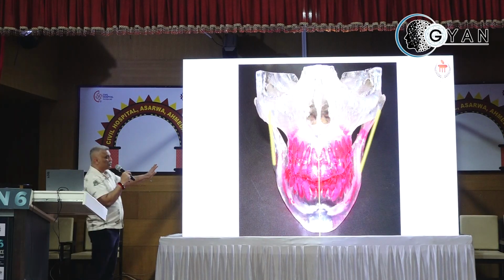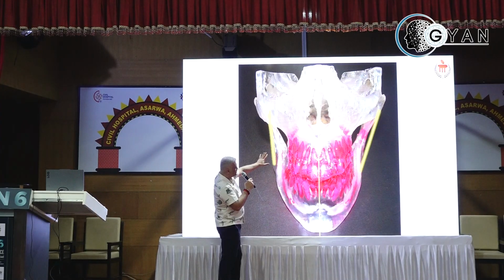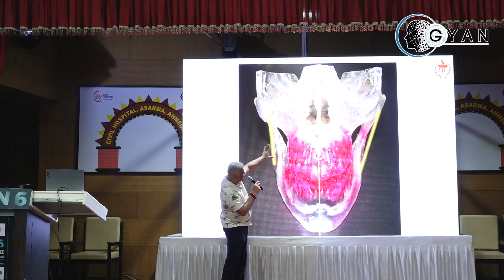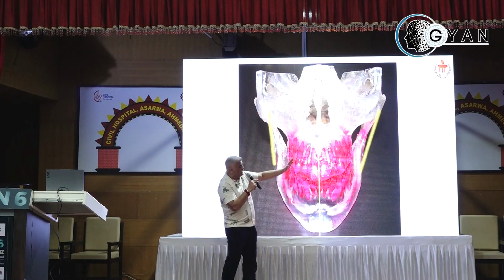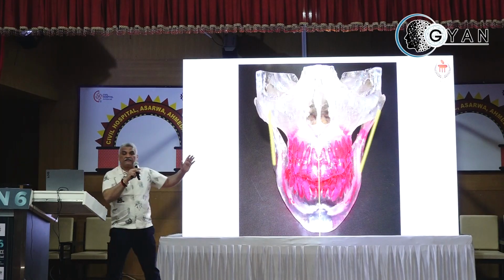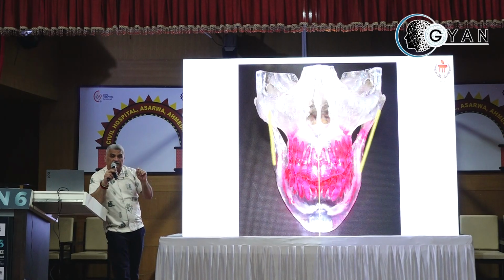And this is an STL model which I picked up when I did my fellowship in Children's Hospital, Toronto. See this particular patient, the same thing what I have spoken about: the vertical ramus on the right side is in line, whereas the left side has an outwardly deviated movement of the condylar head. So the same patient is going to have a stock on one side and a custom on the other side. Now this is just for explanatory purposes. If I have a patient like this, I would settle for a custom joint prosthesis rather than a stock.